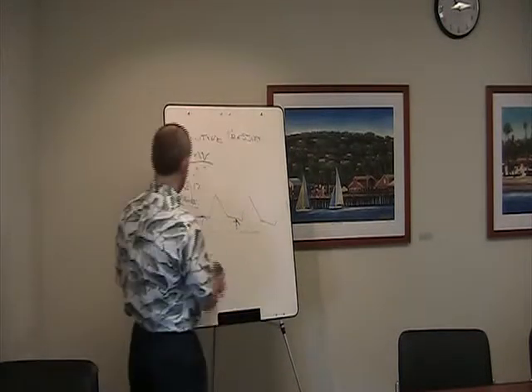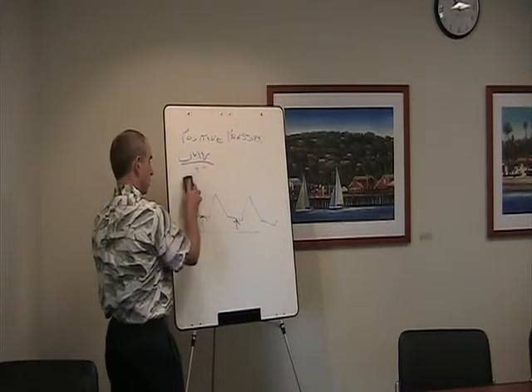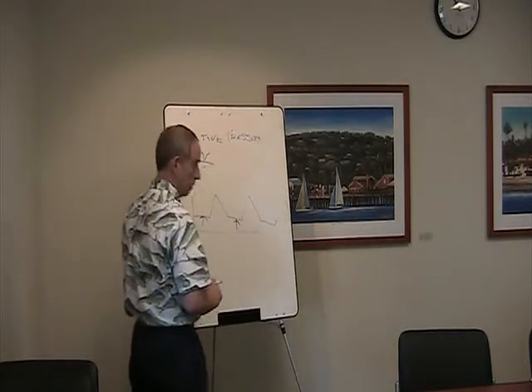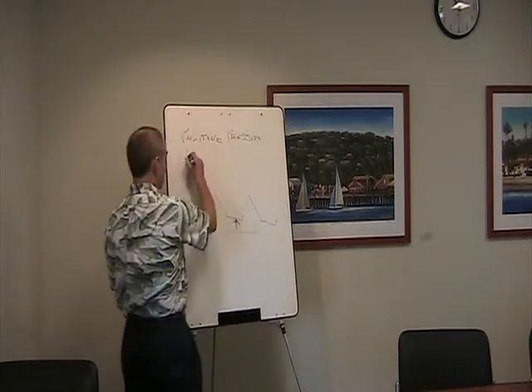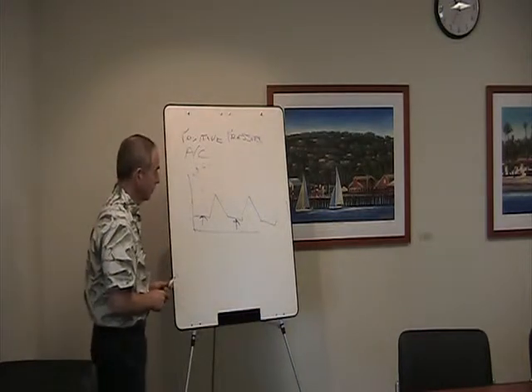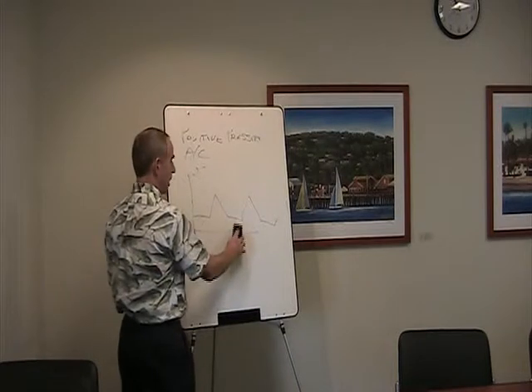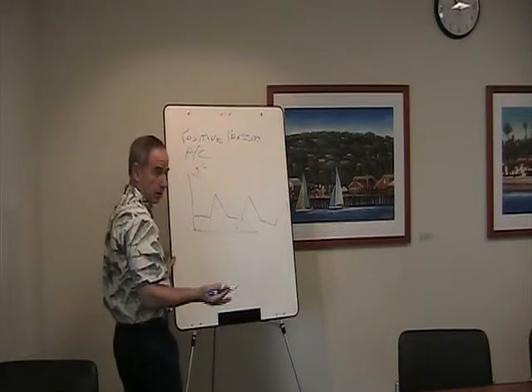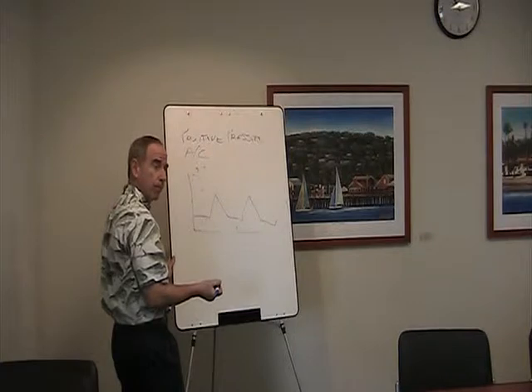So what was the next type of ventilation that was developed? AC. Yeah, so the next type of ventilation that was developed was assist control. And initially it was also pressure cycled. So what's assist control? How is it different? Well, if you use pressure, again, you're setting a pressure, right? Not a volume. And the rate you would set the same. You would set whatever rate you want. But what's the difference between AC and CMV?